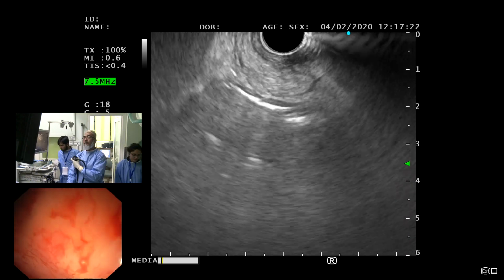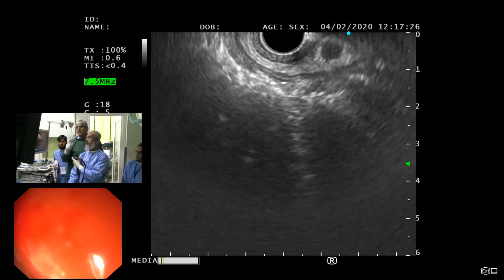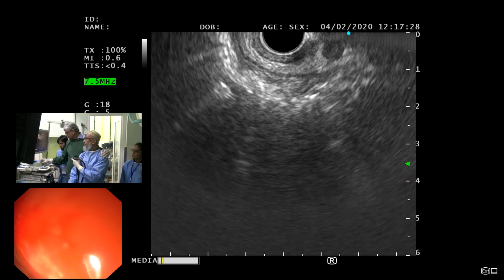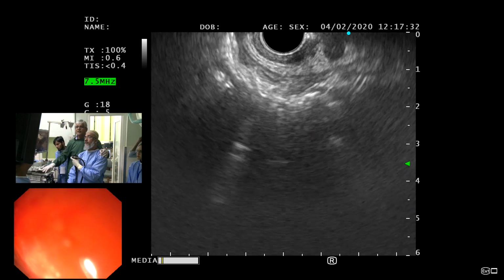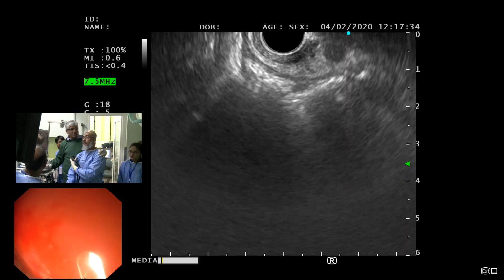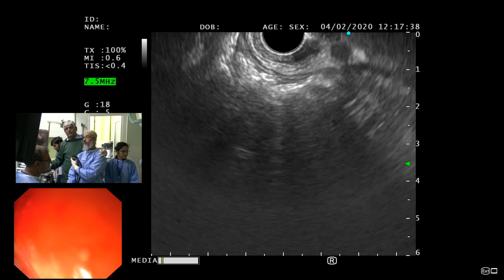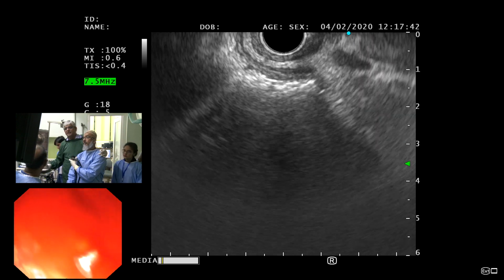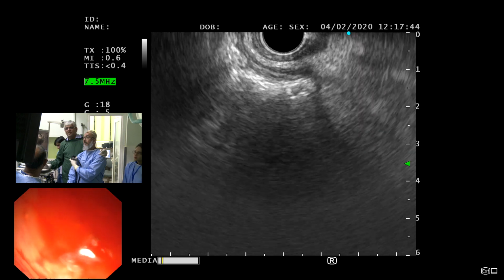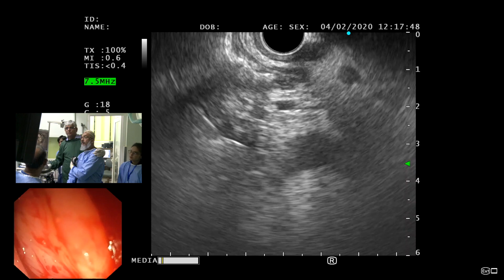Okay, we're done. So Riaz, we've got nice tissue there. So this is good. इसको देखेंगे क्या है? That's a vessel. When you've got a lot of varices, when you have chronic pancreatitis, I find EUS really not much helpful, except for going for a mass and taking biopsies. Other than that, really you're lost because at least I can't make head or toe out of it. Yeah. So we come back.